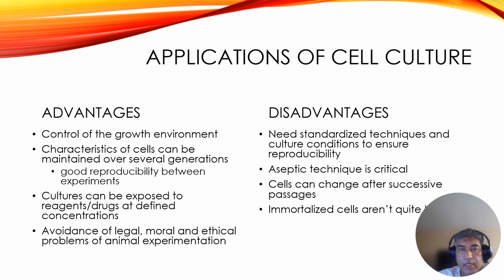Besides advantages, there are a couple of disadvantages as well. Need standardized techniques and culture conditions to ensure reproducibility. Aseptic technique is critical. Cells can change after successive passages. Immortalized cells are not easily handled.